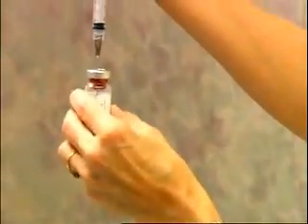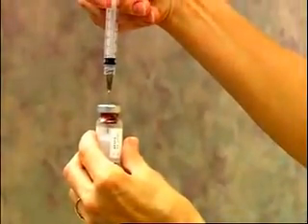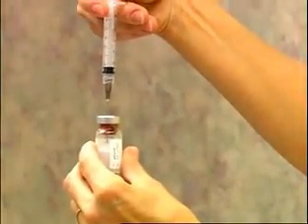Also, because the vial is a closed system, before the medication is withdrawn, air must be injected into the vial. Otherwise, negative pressure results, which makes it difficult to withdraw the medication. Inject the same amount of air above the liquid in the vial as the amount of medication to be withdrawn.